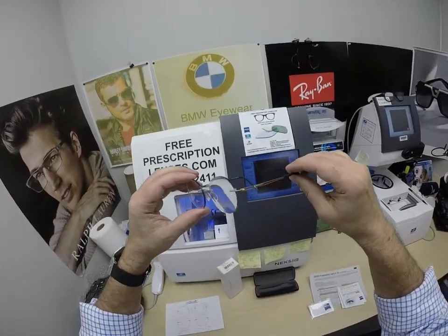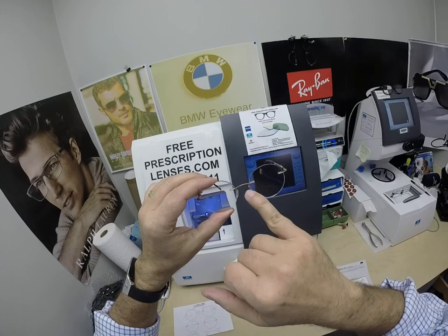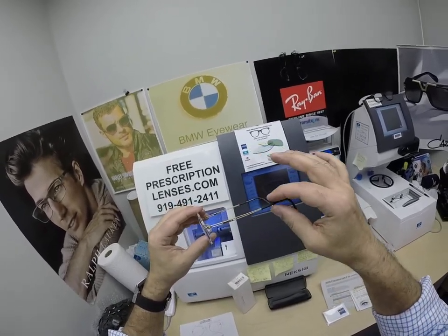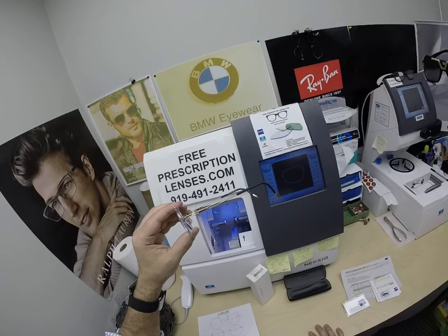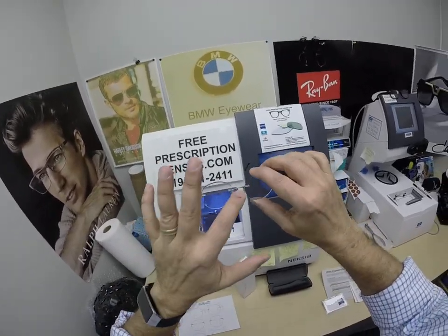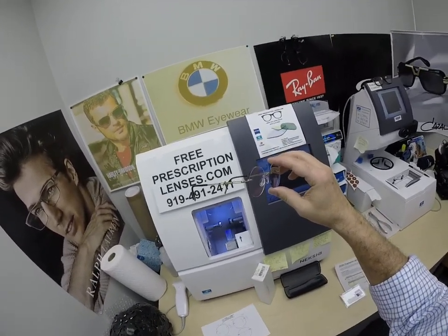Part of the delay in getting these on the website is figuring out how this frame comes with three different bridge widths — 17, 19, and 21 — and three different temple lengths, likely 135, 140, 145, or 150. We'll get that all figured out. But if there's a silhouette frame or chassis that you want, just tell us which one and we can make it happen and get you pricing on everything.